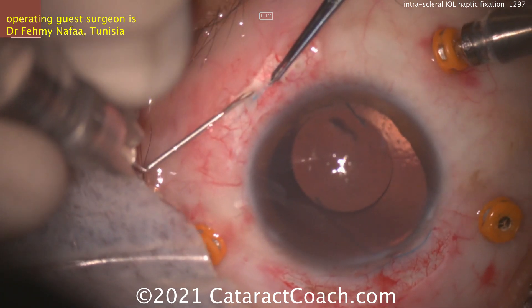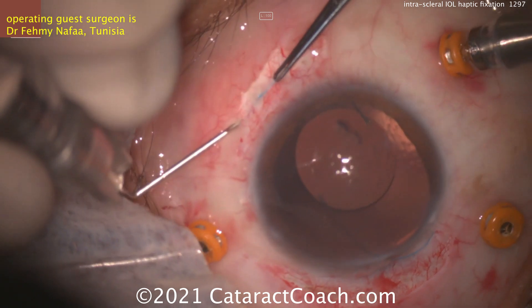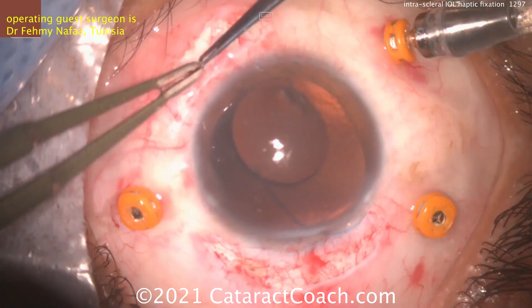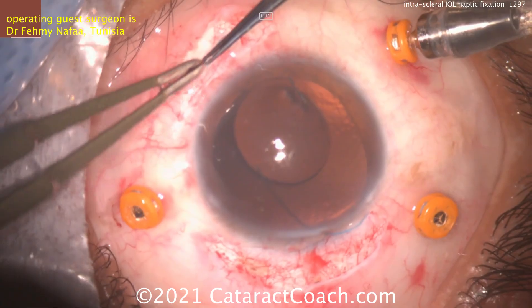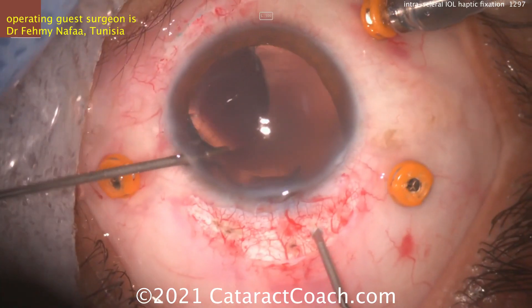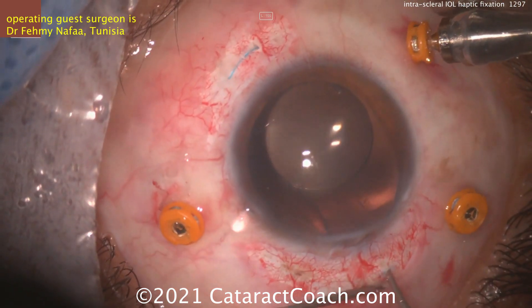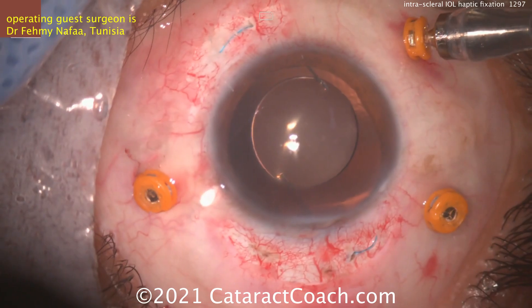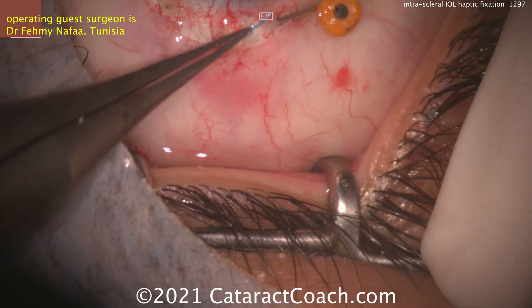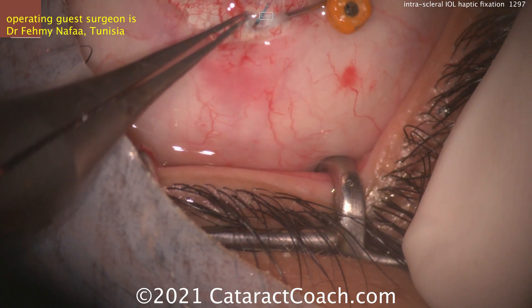The difference between the glued IOL technique and this is that the glued IOL technique creates a little flap so you can really bury this haptic completely. Time to do the other side. This is the handshake technique described by Agarwal to bring that other haptic out — and there it is coming outside. Again, making that tunnel with the 30-gauge needle.